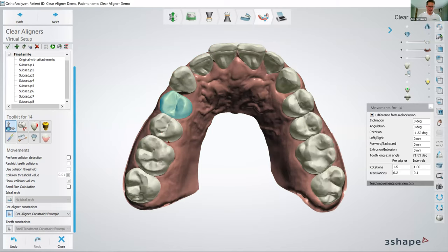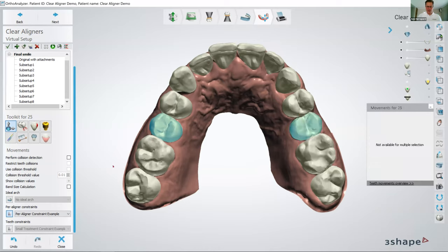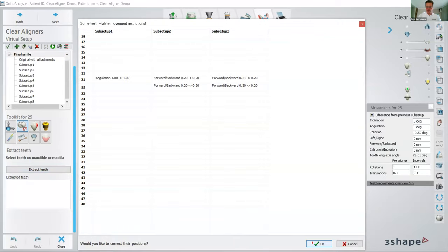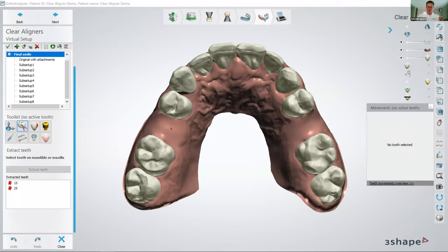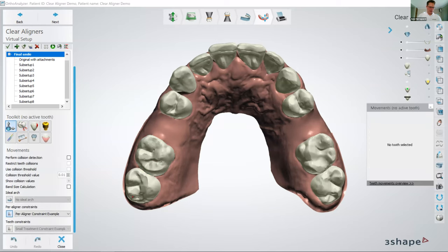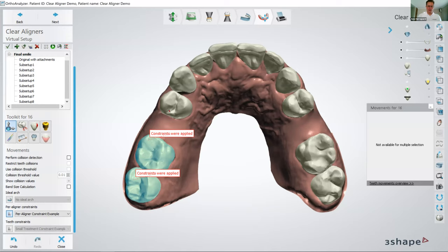I can just show you that you could select a group of teeth. Let's say you want to extract the premolars, then you simply click the teeth and you click extract teeth, and then the premolars will be extracted from the situation here. Yeah, I know. So now you have space, and then you can grab a group of teeth. So we have to go back to the tooth movement, grab a group of teeth, and then you can maybe start to close the space or bring the teeth back and forward and so on.